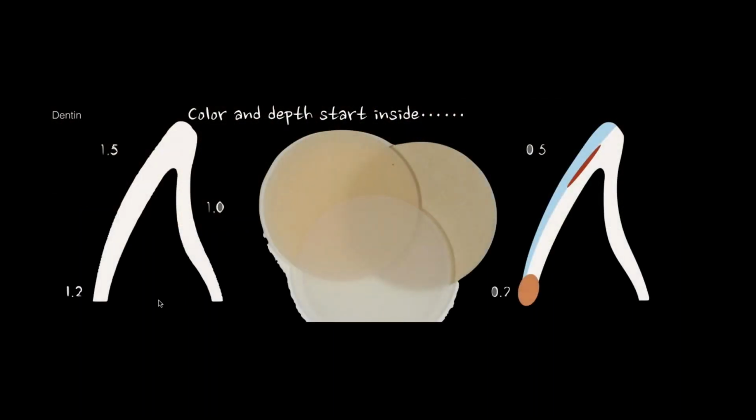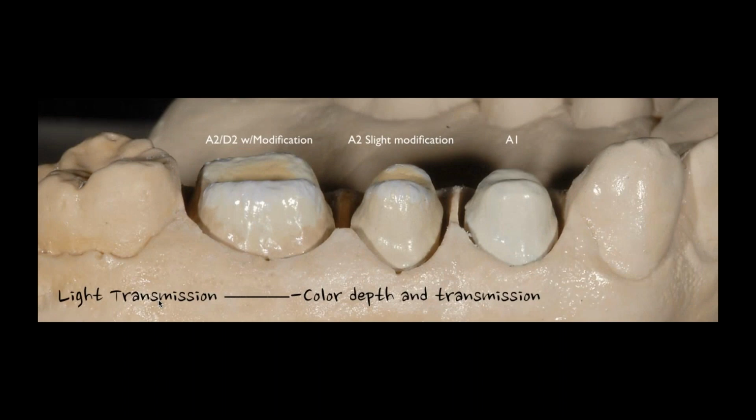So let's dive into the ceramic a little bit more and talk about how this opacity is so important for you. I always say color starts from the inside. And I know that's a challenge for us today because a lot of our restorations are color on the outside. A lot of the monolithic restorations that we're doing, stain and glaze concepts, and I know that's so typical.